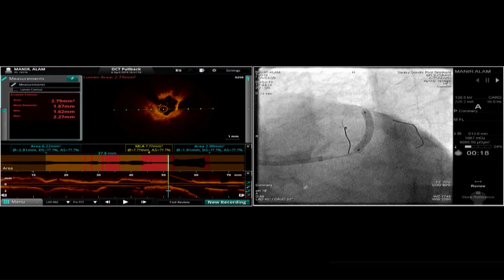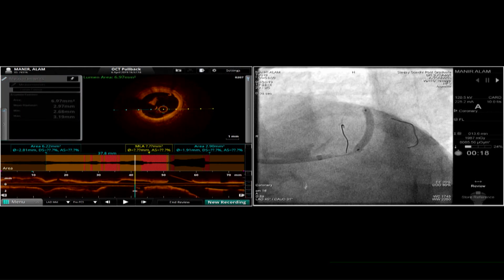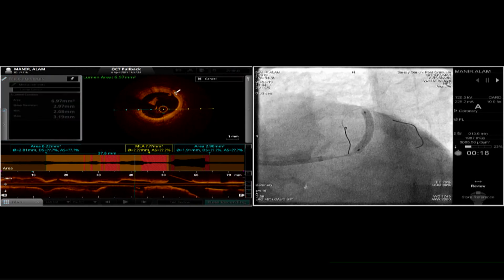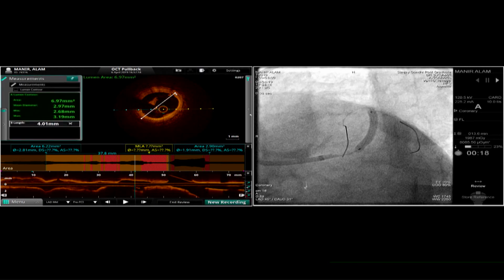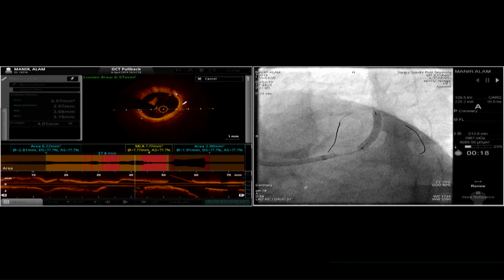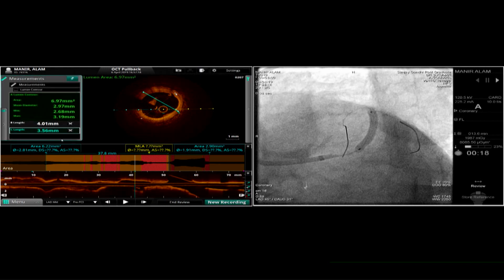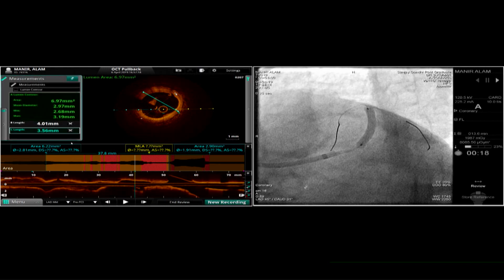So come back on this side around 42, right there. Okay, give me EEL to EEL there. So 3.25 or 3.5. It's almost a 4.0. So we'll take a 3.5 balloon. Yeah, 3.5, 20. 3.5, 20 is good.